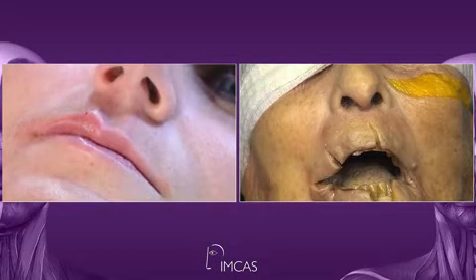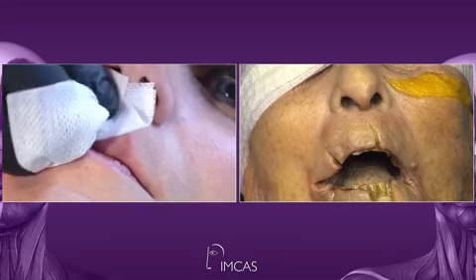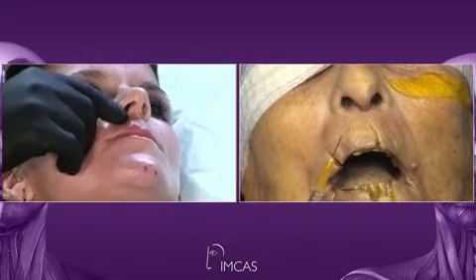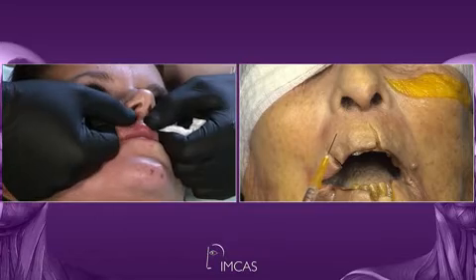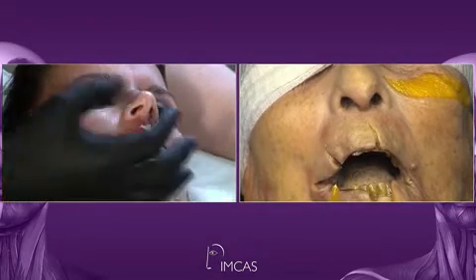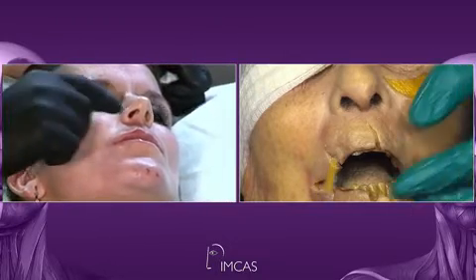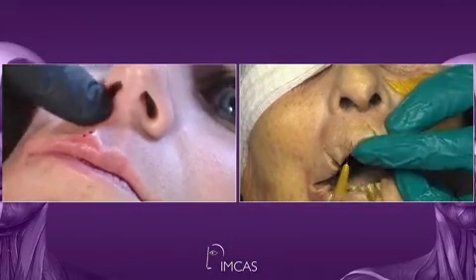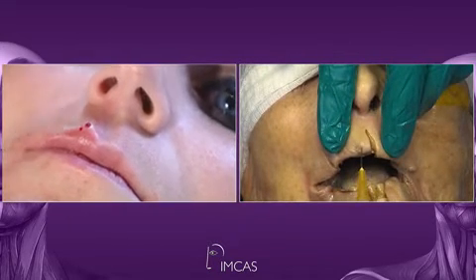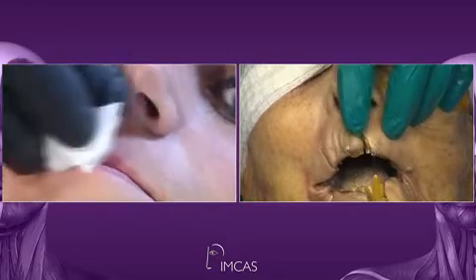So very, very superficial. Is it safe? Frederic. Yeah, it's a very good point. We need to be careful and, as pointed out, not inject large volume. If we do injections in areas like this, of course we need to put a lot of attention to this. It's a small volume, quite superficial, just underneath the dermis, so I think we're fine, but you need to have a calculation of risk in that, of course.